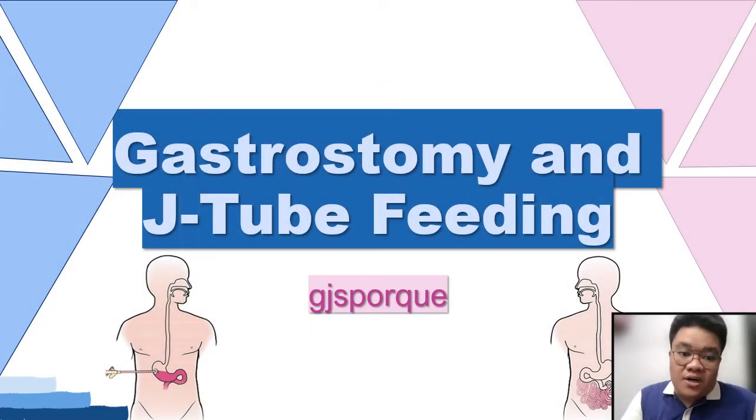Our focus is your gastrostomy and J-tube feeding. So this reminds us that you have several ways of feeding, and it is not only your nasogastric tube that is used for feeding. So you also have your gastrostomy, and then you also have your J-tube. Your J-tube is of course your jejunostomy tube.